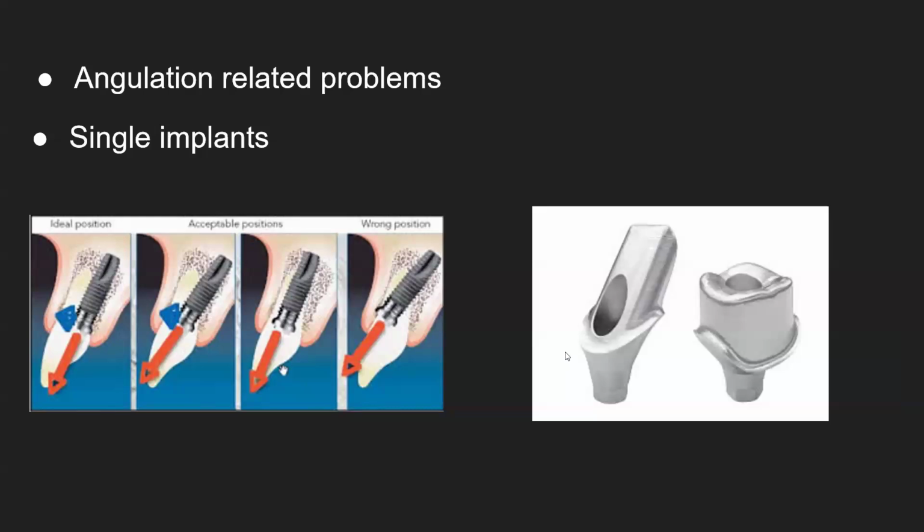The thing that you have to know here is that planning from the first place makes you know what to use in the prosthetic phase. So do not leave your prosthesis for the prosthetic replacement period. No, you should do it in the planning period. We call it crown down technique, or prosthetic plan, pre-prosthetic plan.